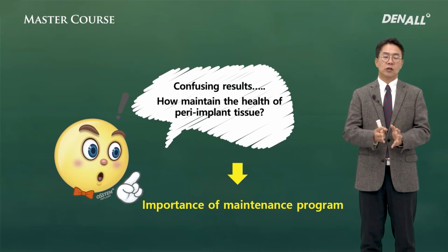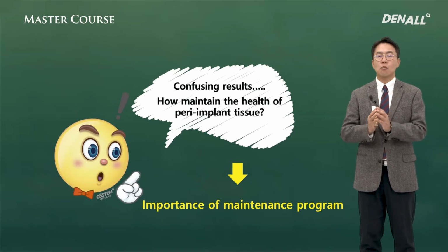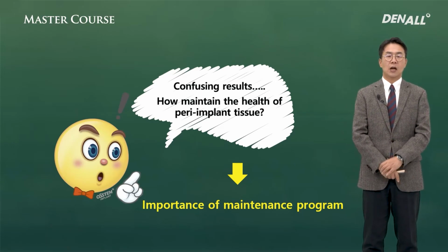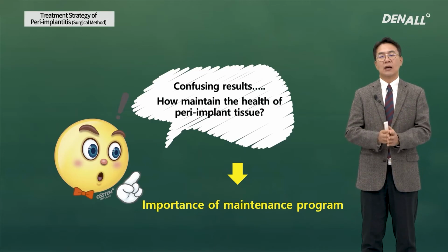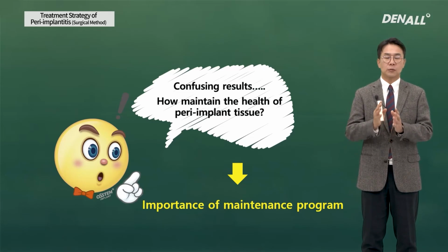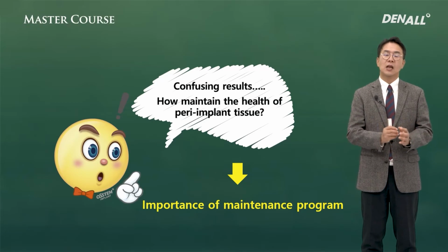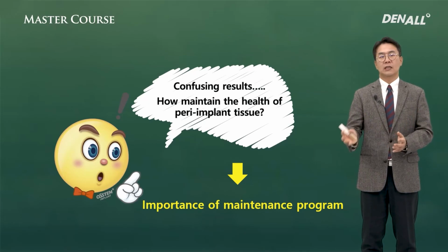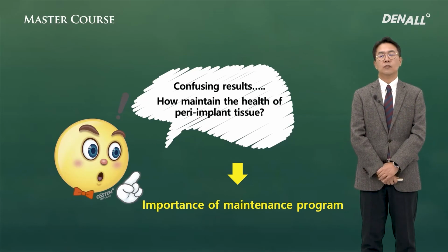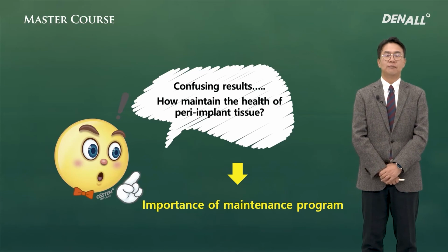It's still too early. I believe that in determining which is better, the most important criterion is the purpose. The purpose of treatment is to halt progression of disease. In addition, if you want to restore function, you should use regenerative therapy. If the primary purpose is to halt the progression of disease, because in terms of inflammation response there was no difference between the two, the goal should be kept in mind, and maintenance and care is very important.